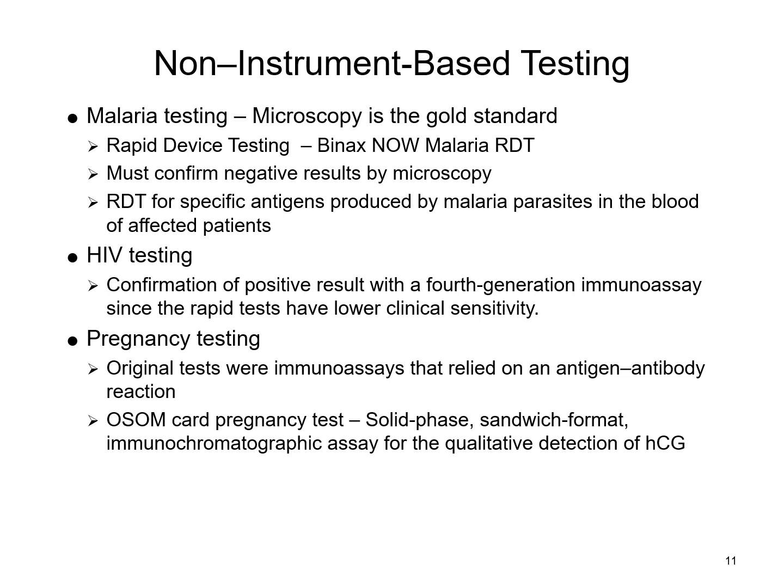When the sample is introduced to an absorbent pad, it will migrate across and bind to some monoclonal anti-HCG dye conjugate, and then you'll get the presence of a visual line.